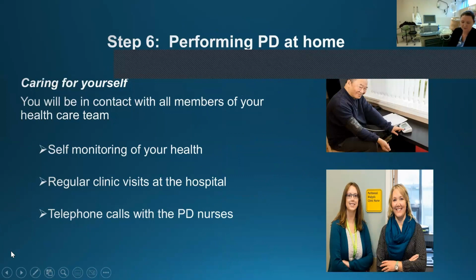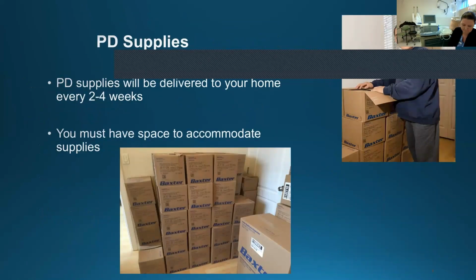Step 6, performing PD at home. So caring for yourself. You'll be in contact with all members of your healthcare team, self-monitoring of your health, regular clinic visits at the hospital, and telephone calls with the PD nurses.